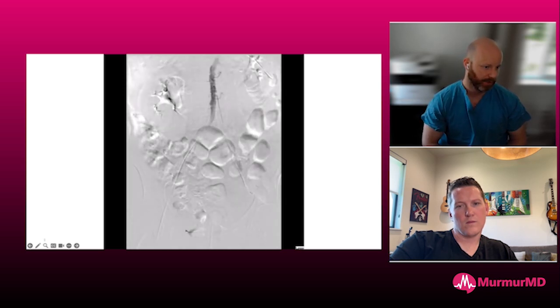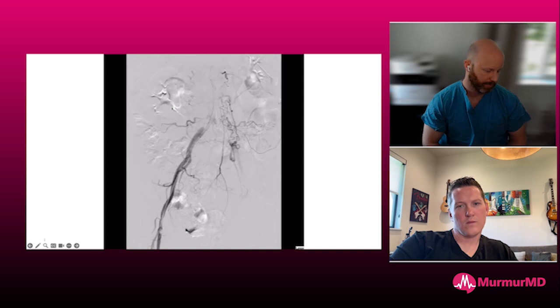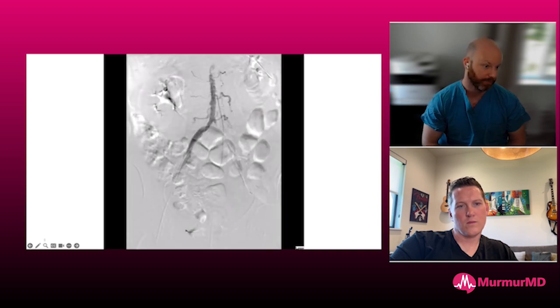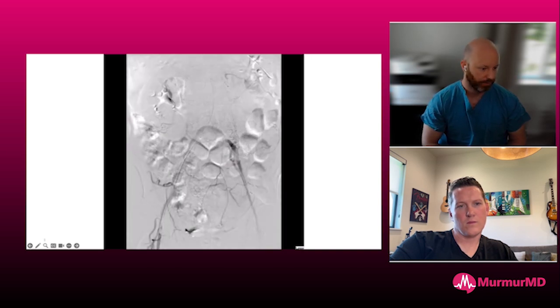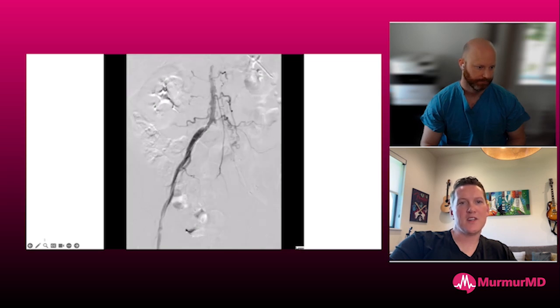So we really like this a lot. And we explant all of our Impellas in the cath lab. We don't do any at the bedside any longer for this exact purpose. We rewire the repositioning sheath. We deploy percloses. We put our 4 French sheath in. We take pictures for everybody, and in particular when the Impellas have been in for a while, because you don't want some sort of thrombus to develop and you did not adequately address it. So from a liability perspective too, I think this is huge because you can document the angiography at the close.